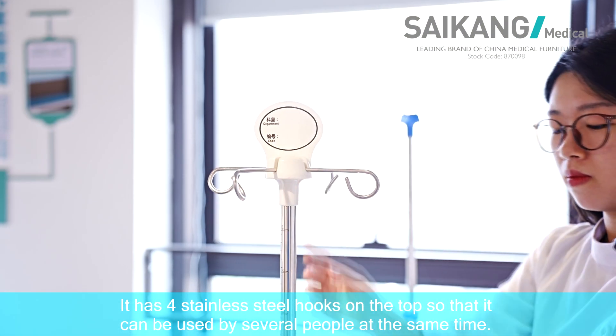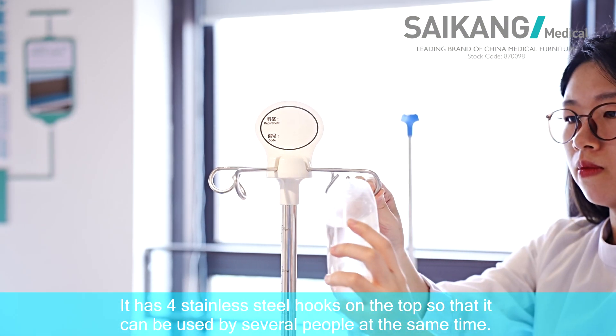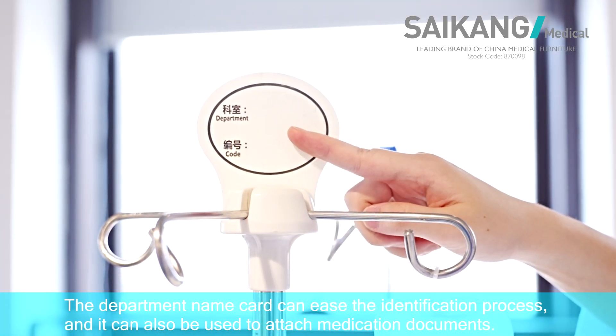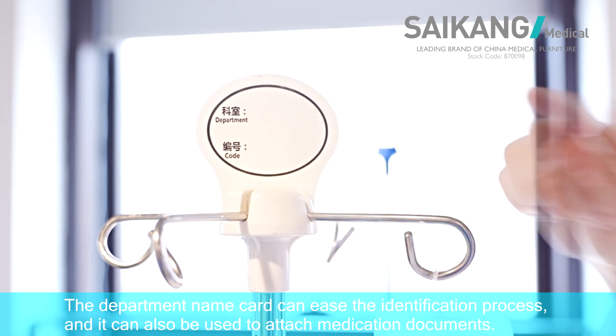It has four stainless steel hooks at the top, so it can be used by several people at the same time. The department name card can be used for identification, and it can also be used to attach medication documents.